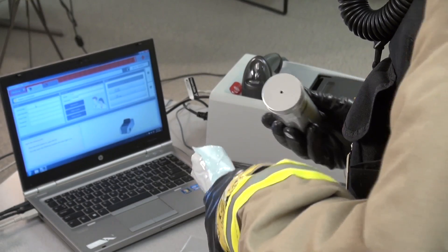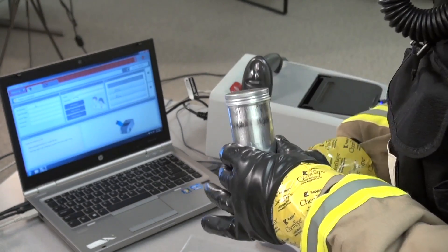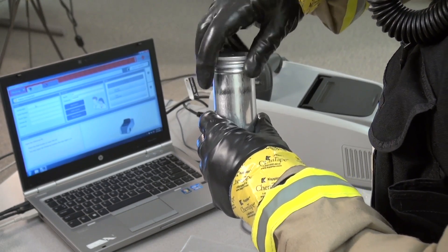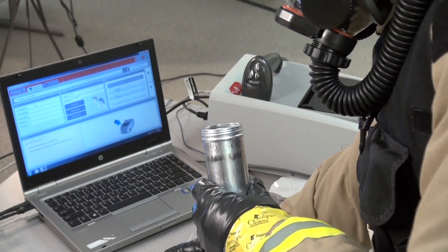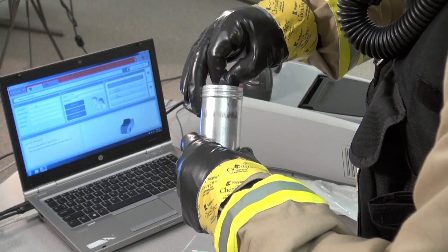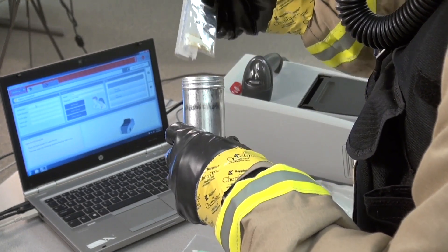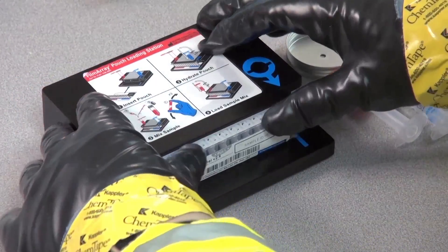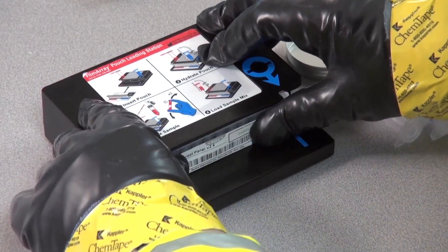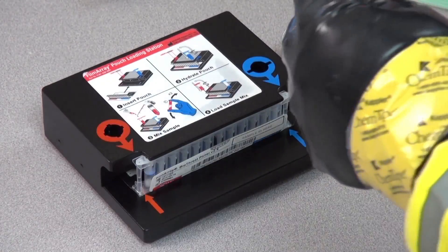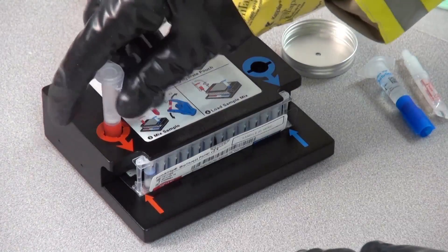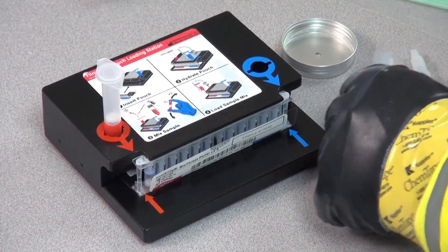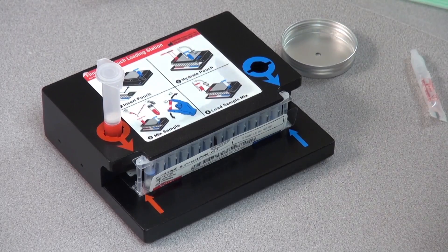To begin, remove the pouch from its packaging. Insert the pouch into the loading station. Place the sample injection vial into the red well of the loading station and the blue hydration vial into the blue well.